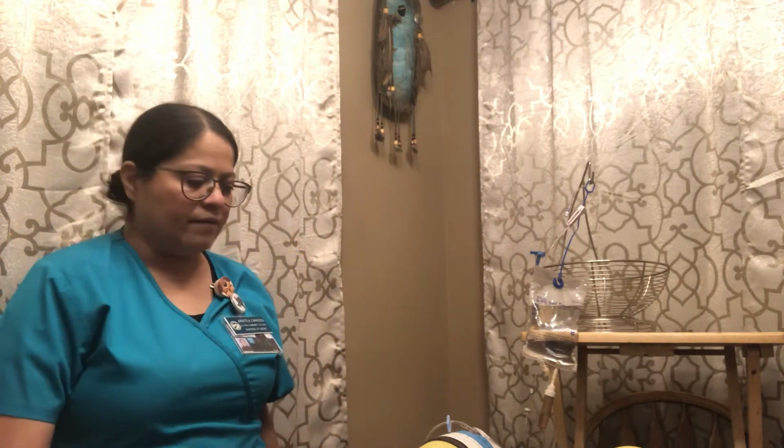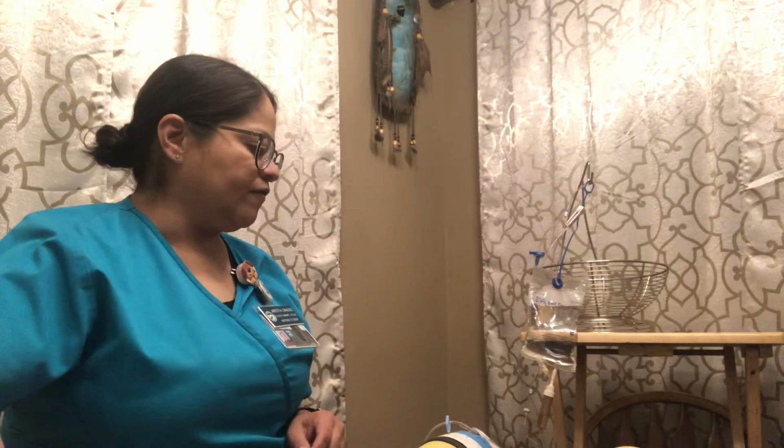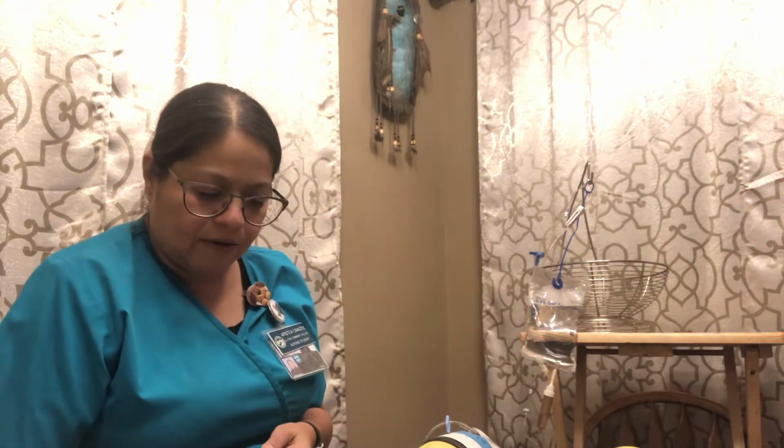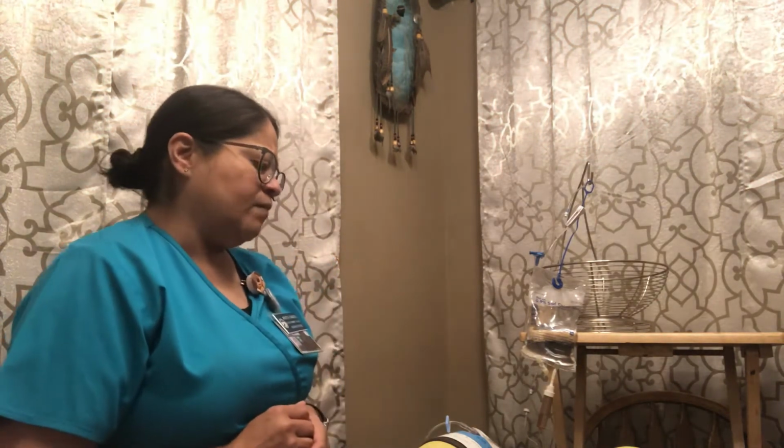So I'm going to go ahead and knock. Hello, Mr. Sunbum. My name is Aristea Cavazos. I'm your nurse today. First thing I'm going to do is go ahead and wash my hands. If you could please tell me your name and date of birth. Mr. Sunbum, date of birth, 12/3/75. Compare that to my electronic record and his bracelet. Okay, 12/3/75. The doctor had ordered some pain medication for you. He said you were in pain.